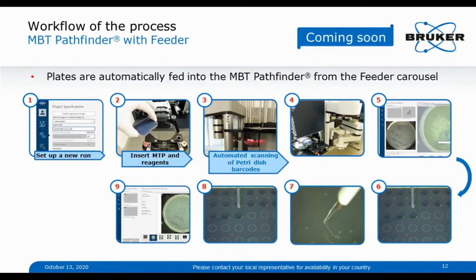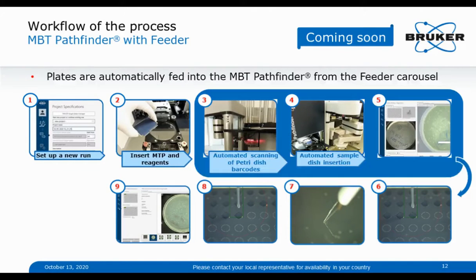After a start, the automated scanning of the Petri dish starts, a barcode that is at the side of the Petri dish, registration of the sample. The sample is automatically inserted into the system. So this part is the connection between feeder and Pathfinder. Then an optical scan of the plate is done.